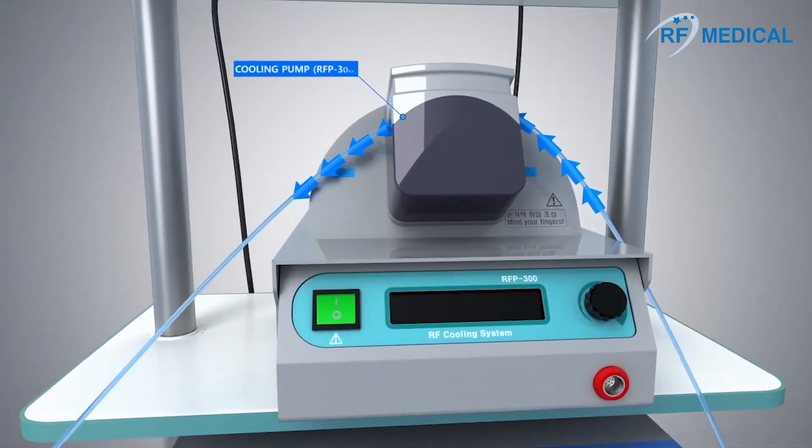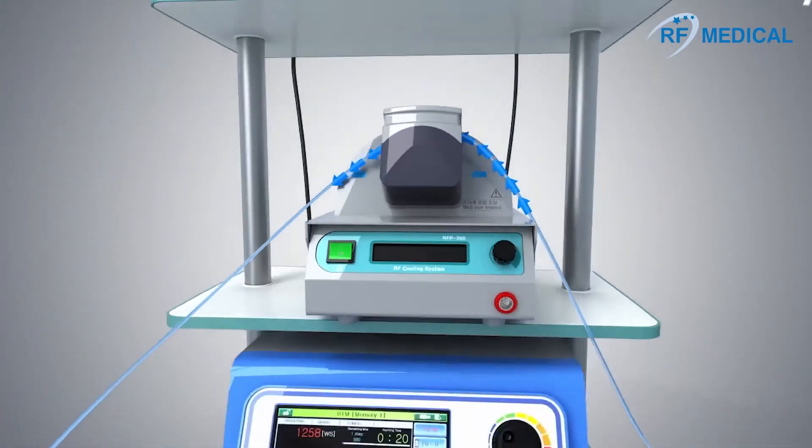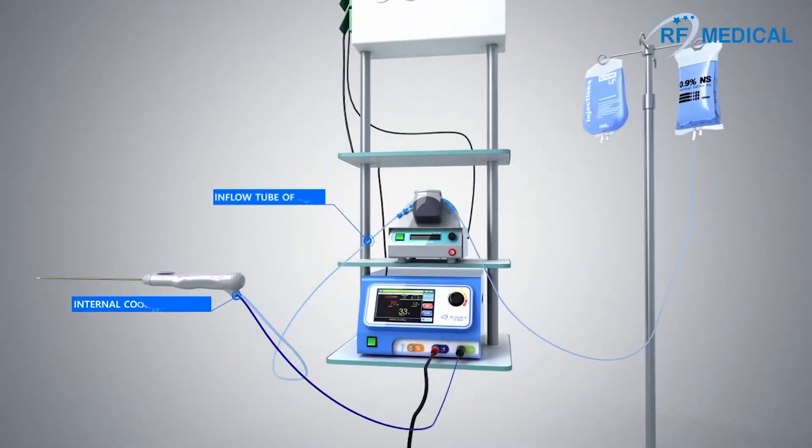The internal cooling of the electrode reduces the temperature of the adjacent tissue in order to prevent carbonization. This allows the emission of energy to achieve a wider ablation zone.